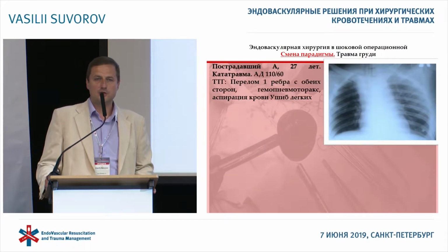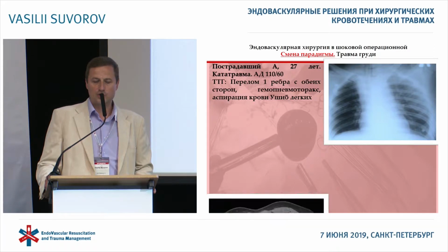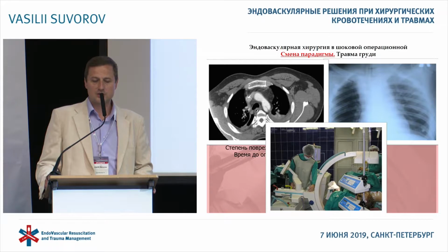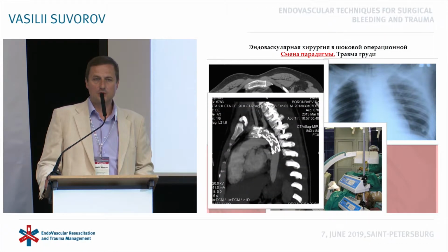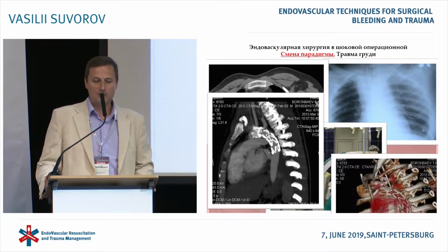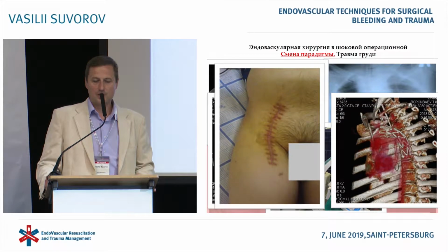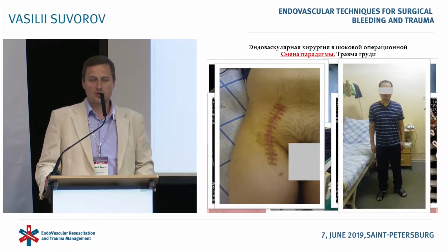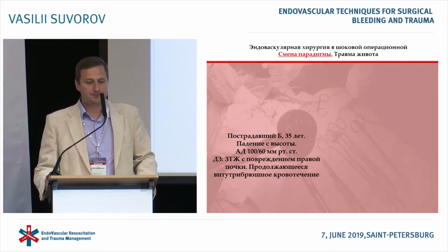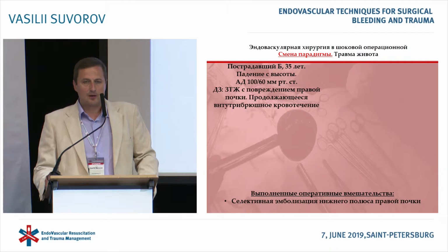Another patient also got trauma, upper mediastinum, CT performed, third-grade damage of aorta diagnosed. Radiological OR, then back to shock OR where we have C-arm with angio equipment, and stent graft was placed. On day 14, the patient was activated, and 2 weeks afterwards discharged.